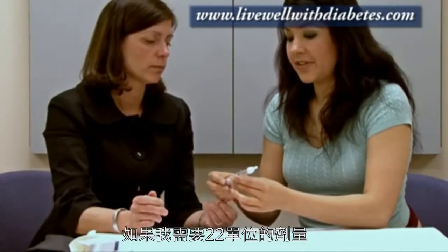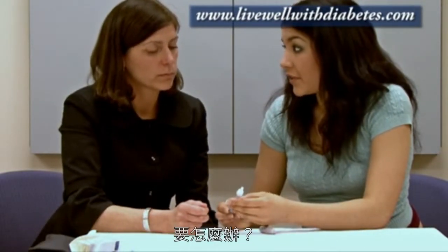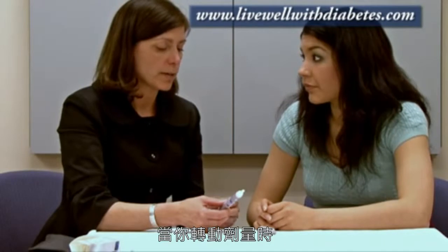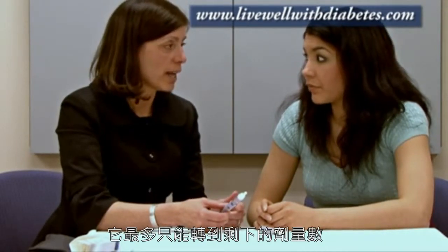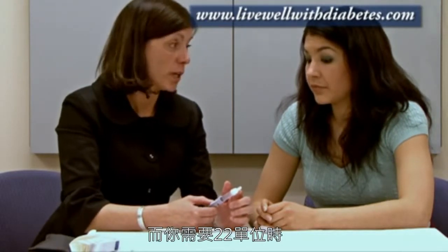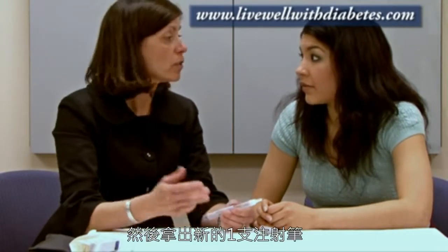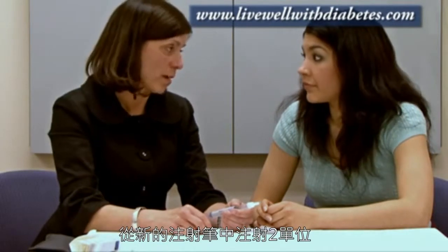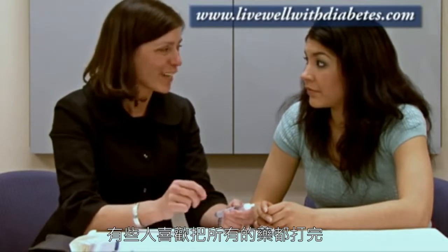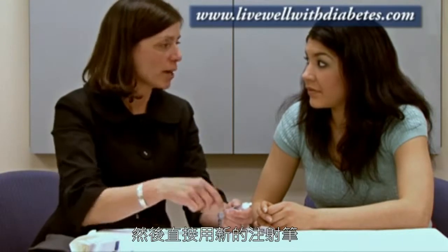What happens if I need 20 or 22 units and there's only 20 units left? When you dial your dose, it will only dial up to how much insulin is left. So if there's only 20 units left and you need 22, you turn it up to 20 and inject it. Then you'll need to start a brand new pen and take the remaining two units from that new pen, which means two pokes that day. Some people prefer to use it to the last drop; others would rather have just one poke and waste whatever's left and start a brand new pen.